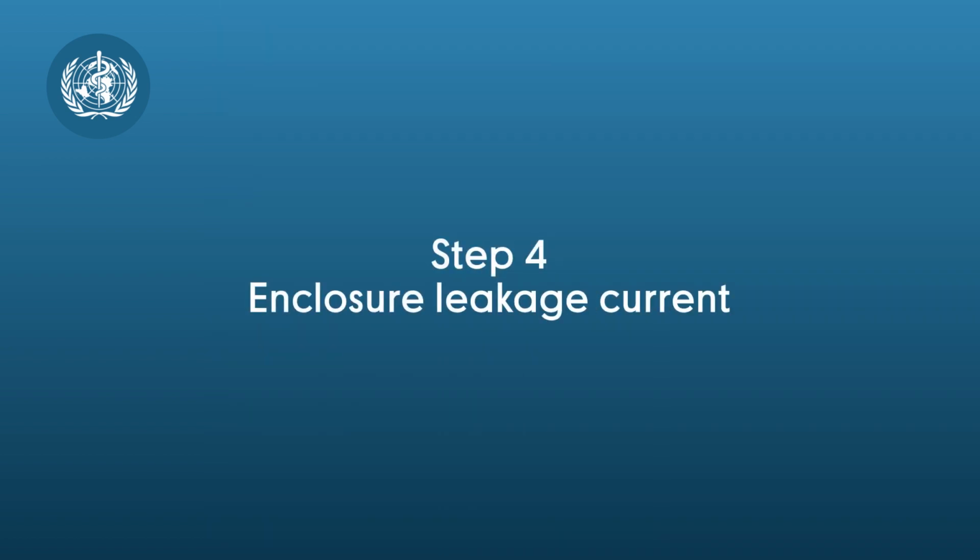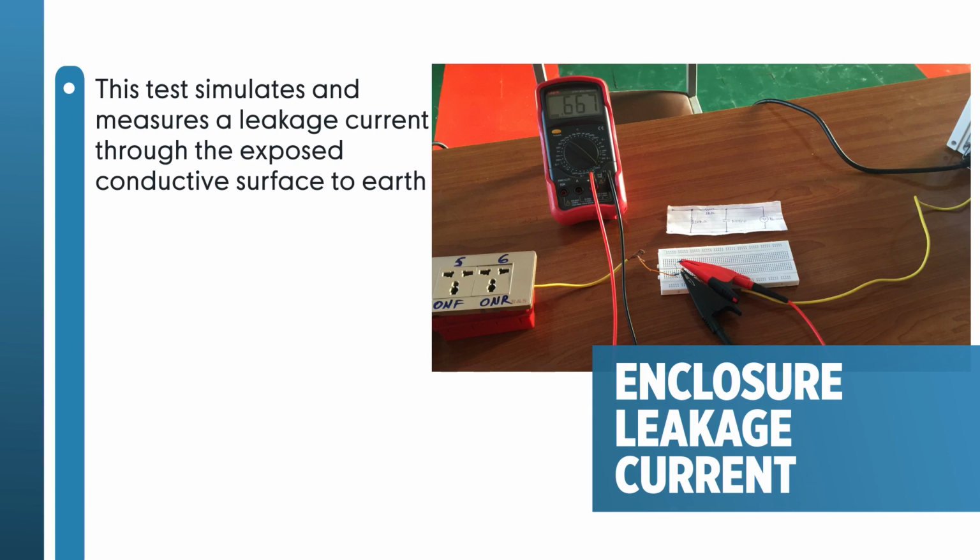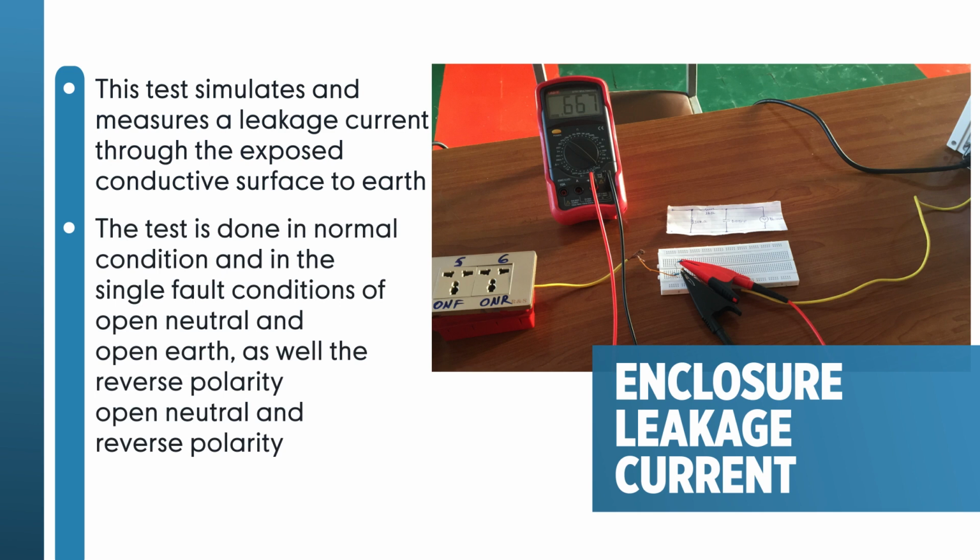Step 4. This test simulates and measures a leakage current through the exposed conductive surface to earth. The test is done in normal condition and in the single fault conditions of open neutral and open earth, as well as the reverse polarity, open neutral, and reverse polarity.